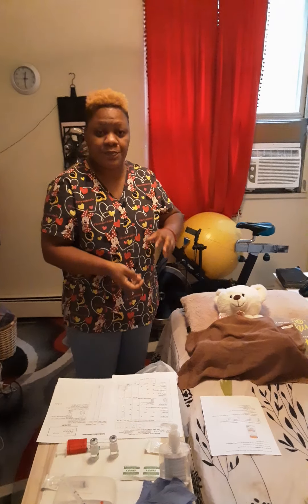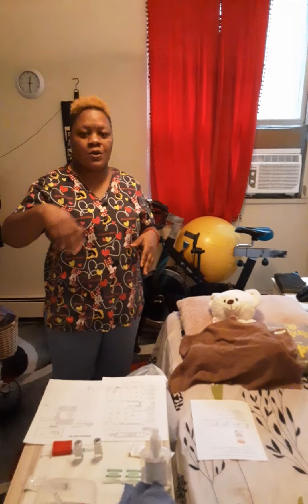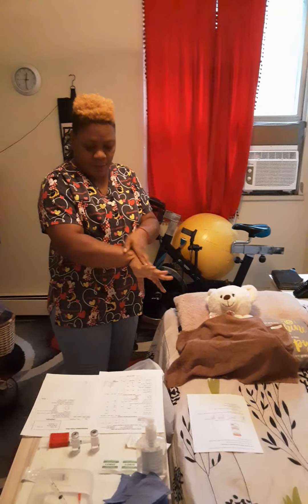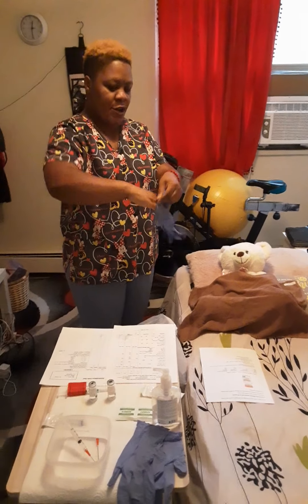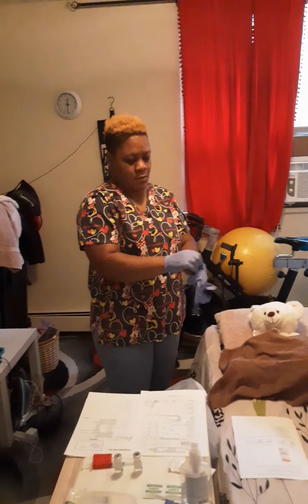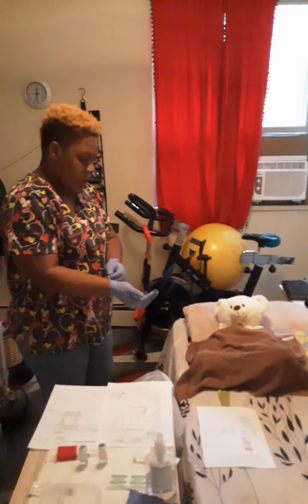I'm going to place my medication down and I'm going to prepare myself to go into the room to see the patient. I am going to do hand hygiene and I'm going to wear non-sterile gloves.